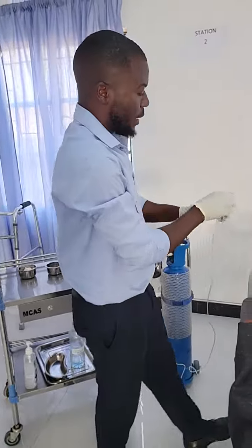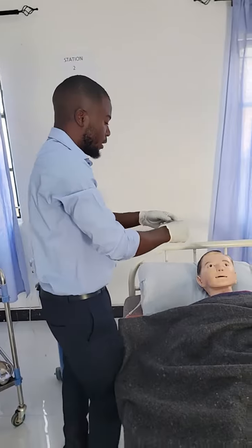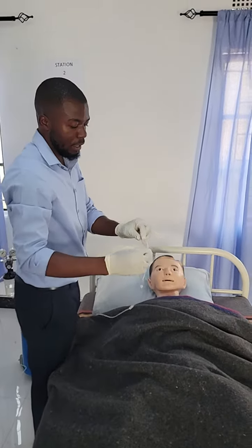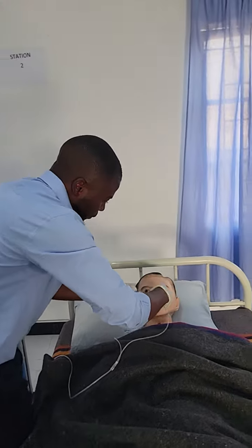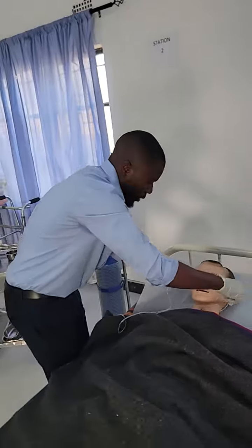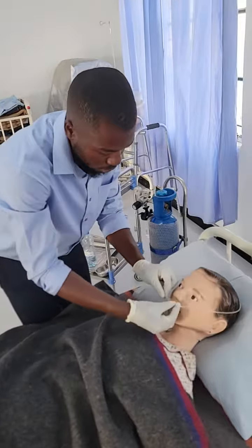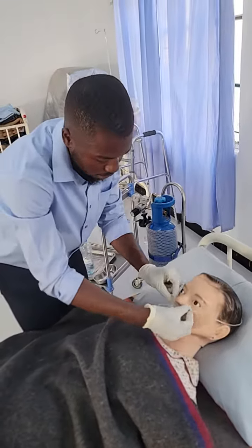So let's now connect it to the patient. This thing, how it's made, way back people used to do this. They used to place it like this, and then do this behind. So this is how people used to place this thing. But this time around, things have changed, and the recommended way is this.